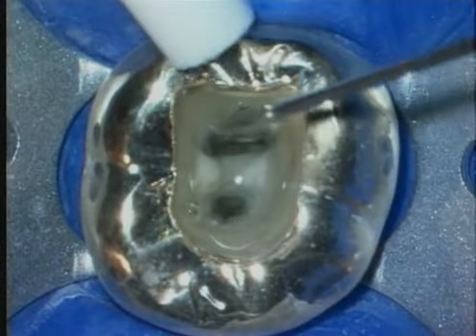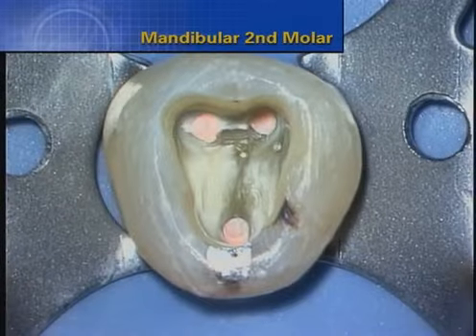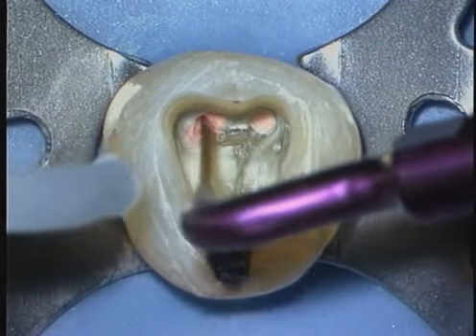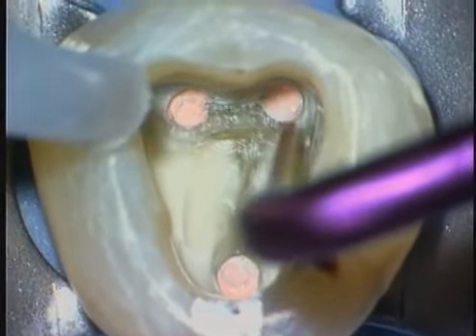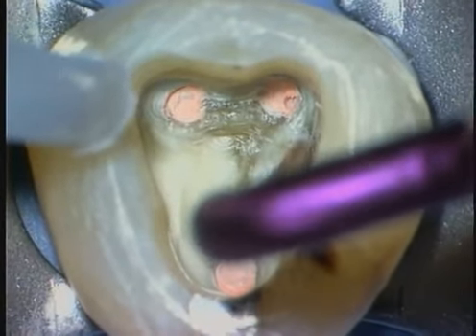The finished access cavity can be topped off with an appropriate irrigant. This access cavity looks correct. Notice the distal orifice is uniformly centered between the MB and the ML system. Ultrasonic energy can be used to chase along the isthmus between the MB and the ML, as sometimes a missed canal can be located within that groove.